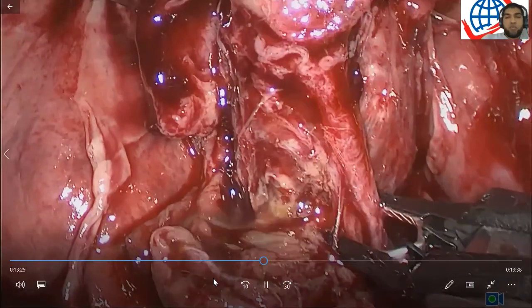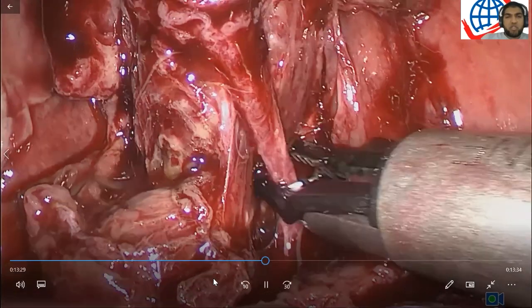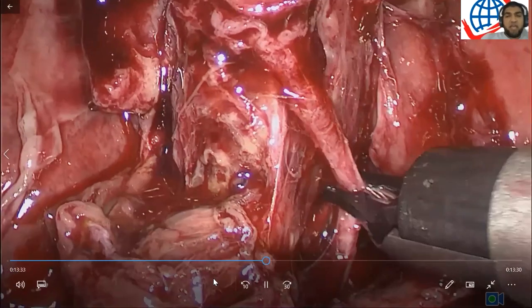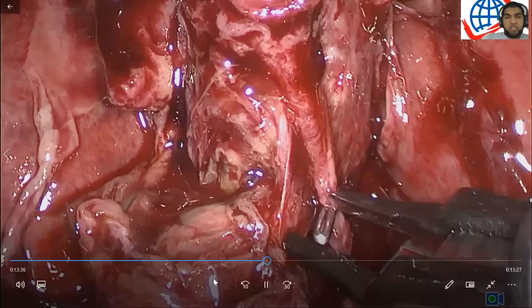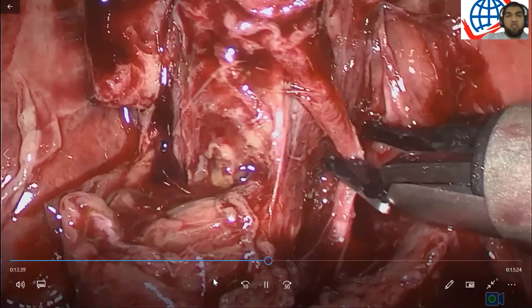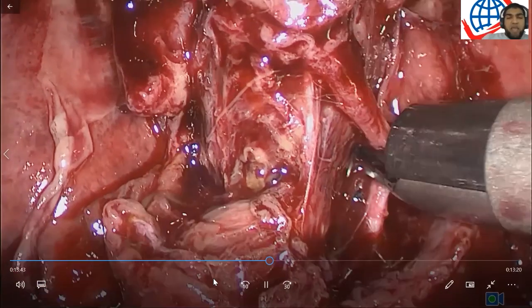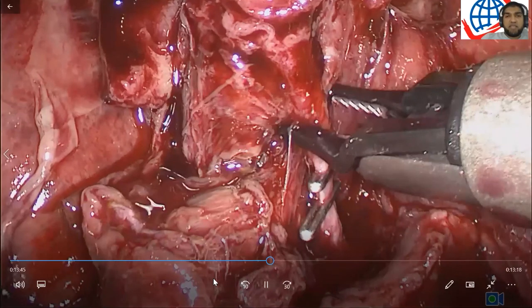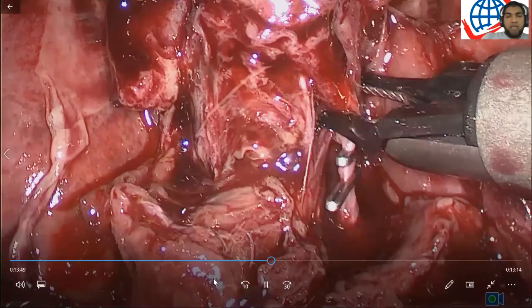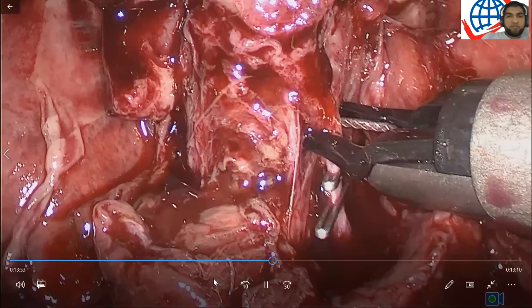So essentially what we're doing here is we think that this may be the cystic artery. We're not absolutely sure. Maybe a prominent mesenteric vessel, and you'll find that with neovascularization in a case where there's a lot of inflammation, there are a lot of vessels getting in your way. But we can see it's nicely, freely dissected. This is going directly into the gallbladder, and we're quite happy to clip it, get it out of our way so that we make more room for ourselves.